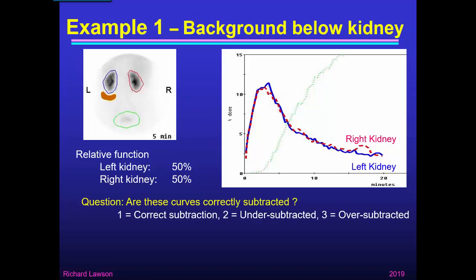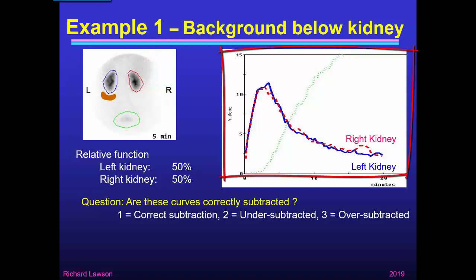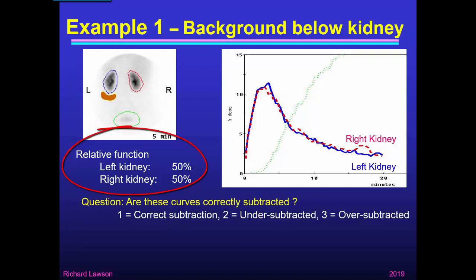In this example, we can see the five-minute image showing I've drawn a region of interest in blue around the left kidney and in red around the right kidney, giving these renogram curves, which have been subtracted using a background region chosen below the left kidney. You can see that the function of both kidneys is equal — 50% to each kidney — as shown by the fact that the curves rise equally quickly.